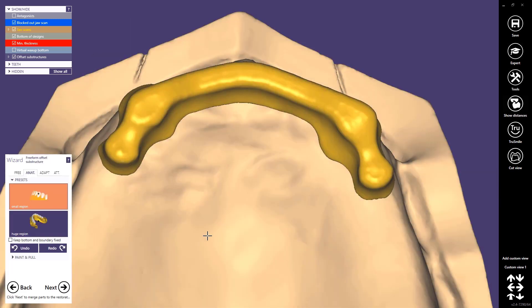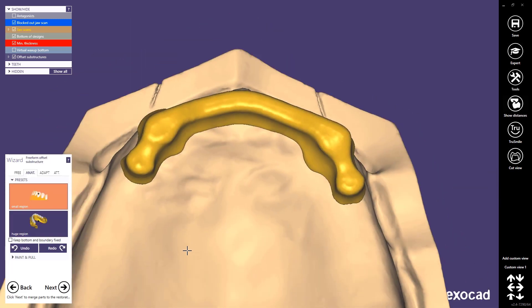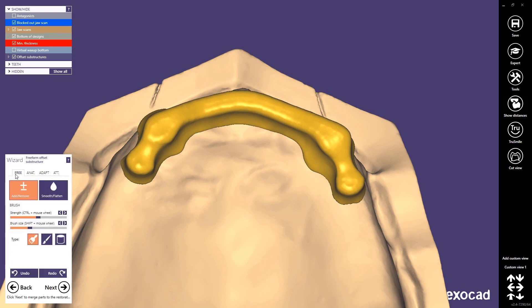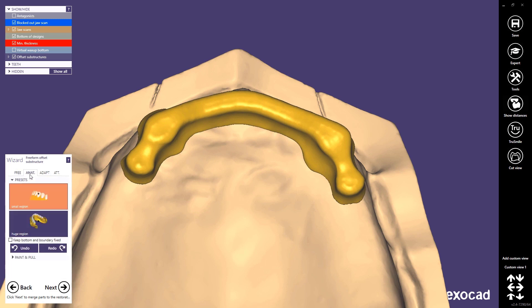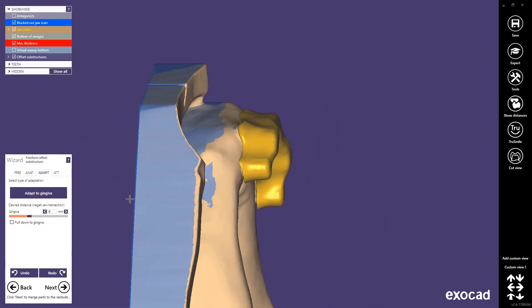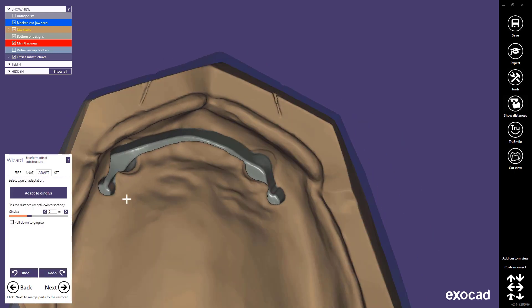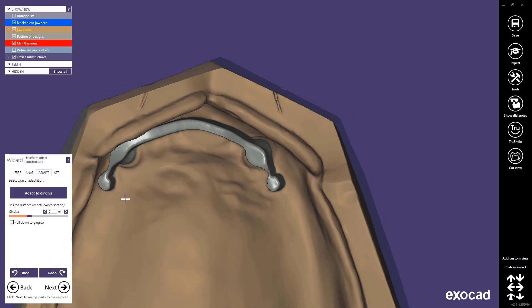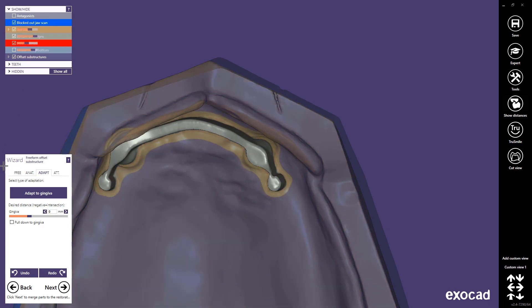In the last wizard step we have the possibility to freeform the offset substructure. We can do this free or anatomical. Let's now adapt the offset substructure to the gingiva. In this case we can use the result as the offset substructure.